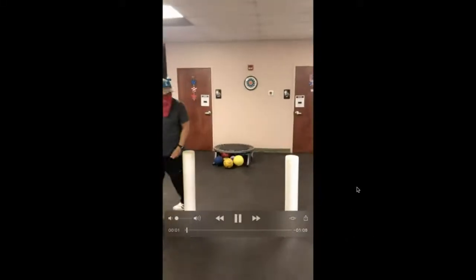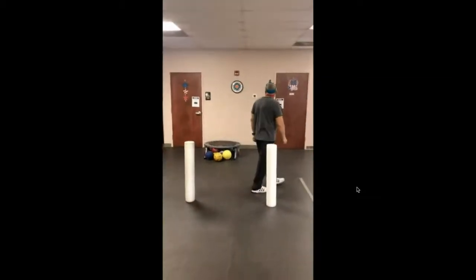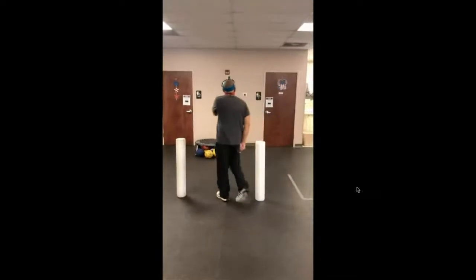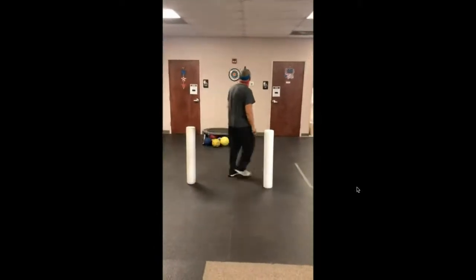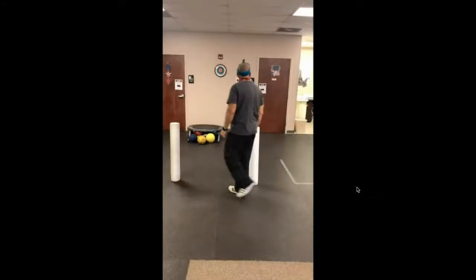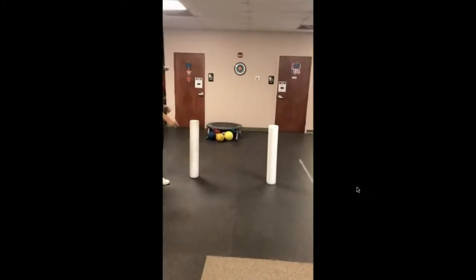So if we play this, you'll see here, as he moves through again in the infinity pattern, he keeps the laser on the target as long as he can, and then he'll take his head away. So it goes through a large cervical excursion and a body rotation there to come back. So this is the task. And you'll notice a few things on this task as we kind of run this through, and then we'll back it up again.